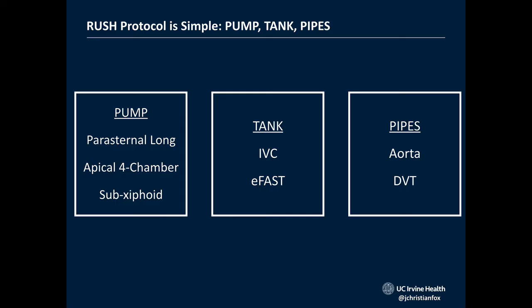With the pump, we're going to be looking at 3 views of the heart. With the tank, we're doing an IVC approach as well as an eFAST. And with the pipes, we're looking at the aorta and the DVT.